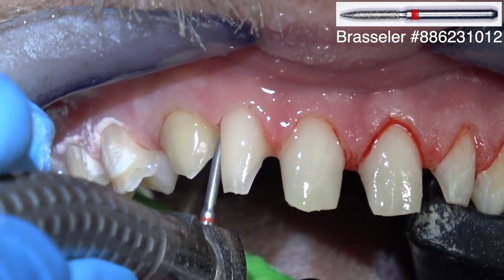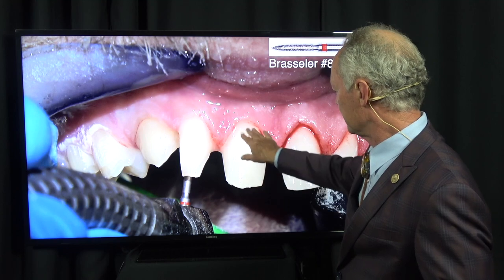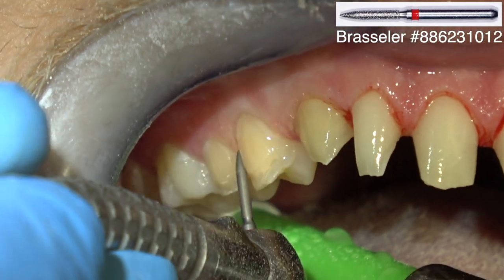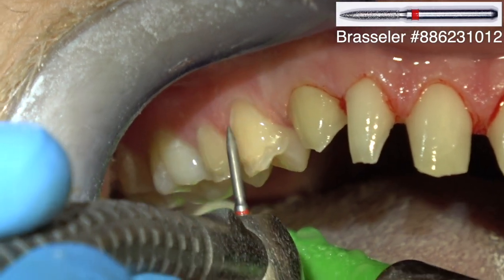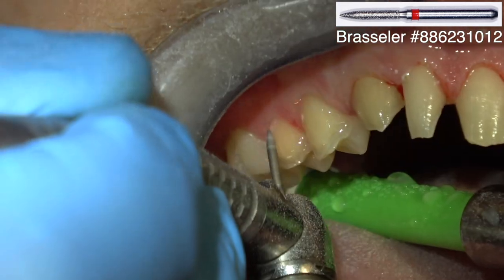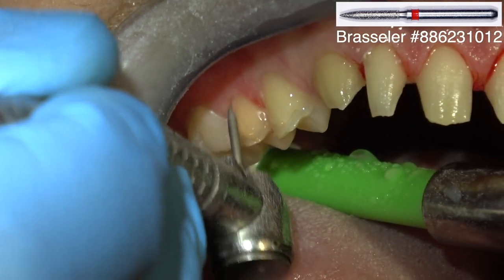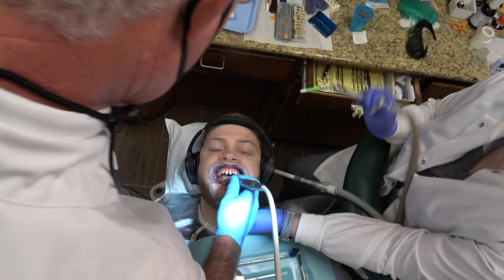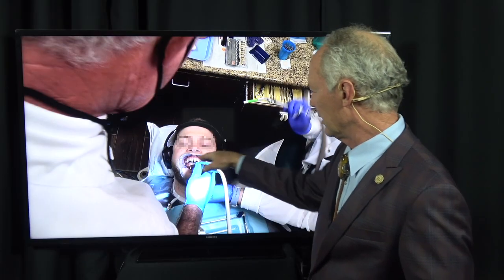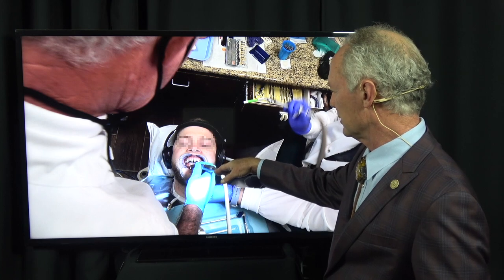You never want to just prepare the facial surface of the teeth. That sounds good, but it's terrible because you don't know that you've seated it correctly because it'll swim all over the place. Again, only about just partway into the interproximal contact of the bicuspids and between the second bicuspid and the first molar.